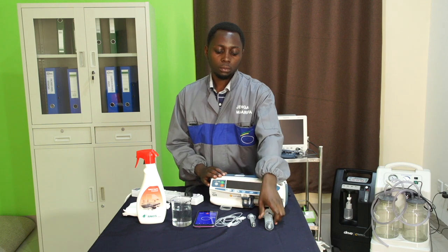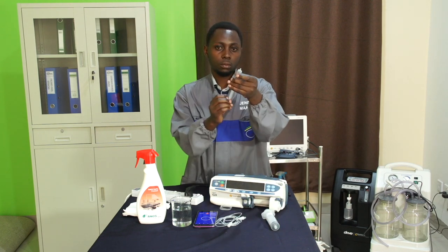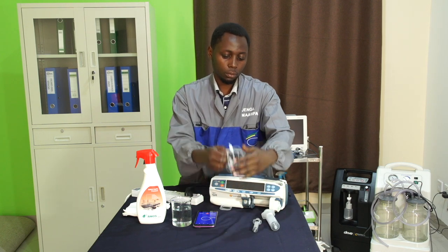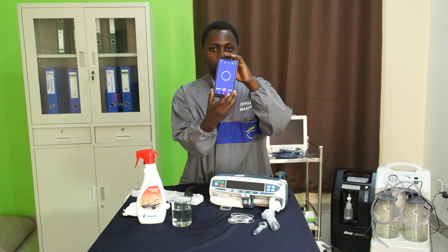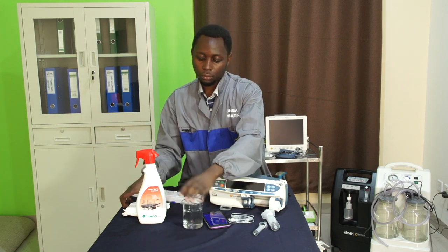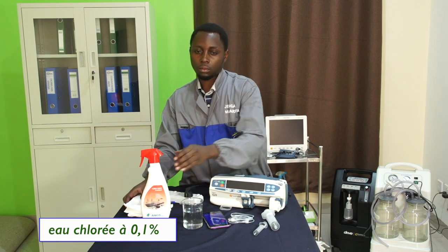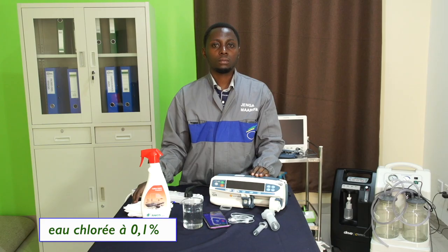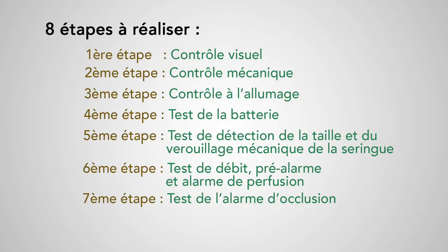De quoi avons-nous besoin ? D'une seringue de 50 ml, d'une seringue d'un autre volume comme 10 ml par exemple, d'un prolongateur adapté à cette seringue, d'un chronomètre, d'un bocal avec de l'eau et du produit détergent désinfectant spécifique pour dispositifs médicaux ou de l'eau chlorée à 0,1%. La procédure que nous vous proposons ici se décline en 8 étapes.